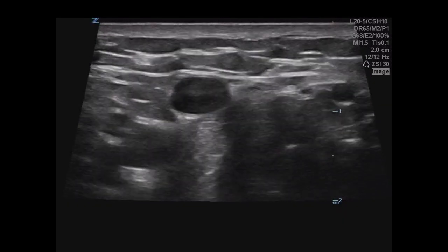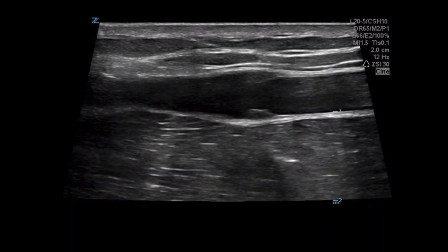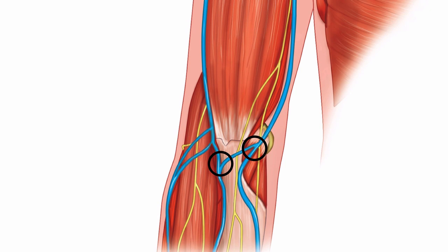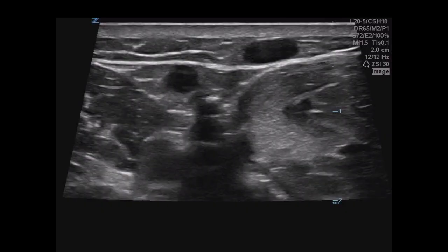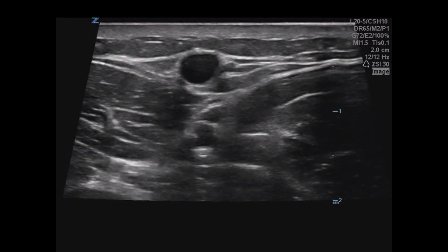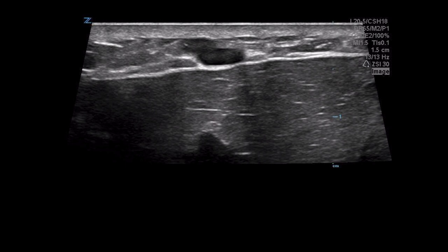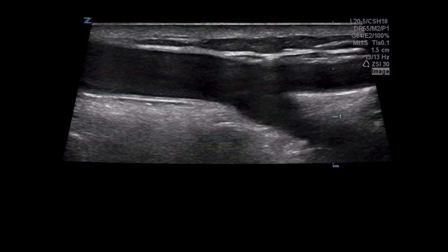As you scan along the vessel, watch for little bulges — these are the valves in the venous system. You can pass a catheter through a valve, but do not puncture directly into the valve itself, as damaging a leaflet can cause venous insufficiency. Also watch for bifurcations and branch points. Avoid accessing at the branch point; access either branch or more proximally. In a transverse view, if you see two veins joining, do not stick through the posterior wall of a superficial branch into a deeper branch.